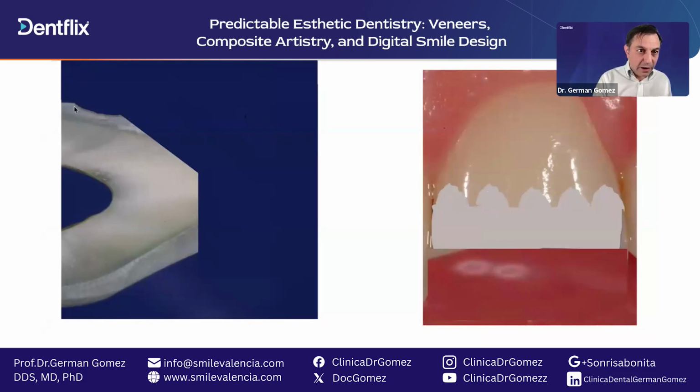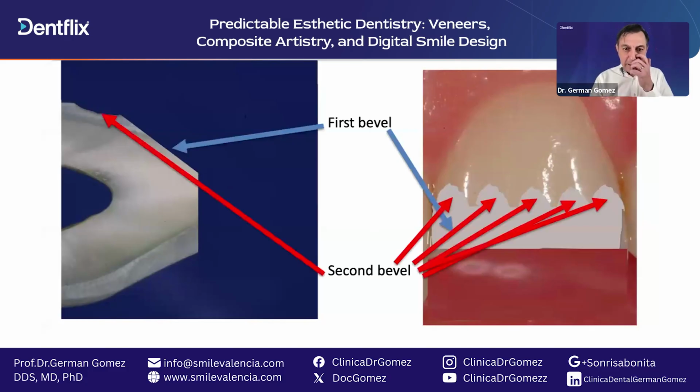This point here is this point here, but now a little bit deeper, and here is this point. Good: first bevel and second bevel.